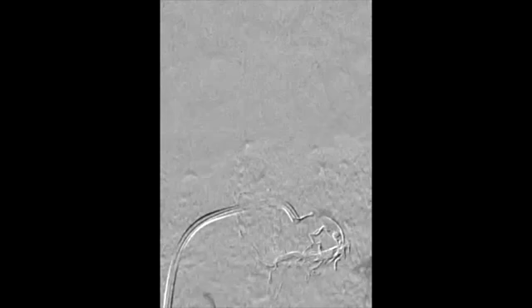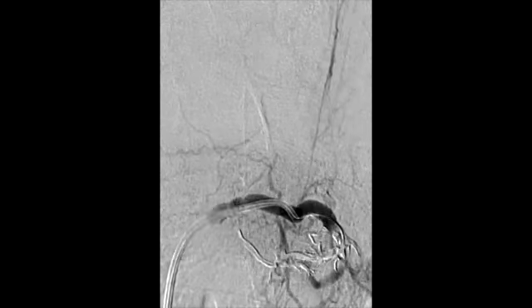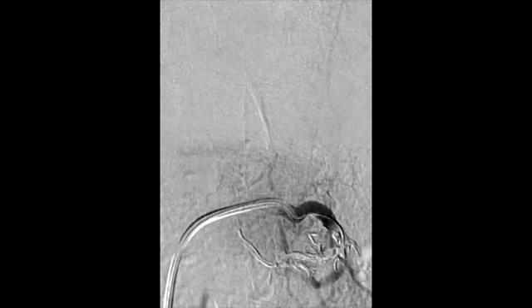fistula. The goal was to occlude the fistula point and in a retrograde fashion deploy Onyx within the arterial system. Onyx is deployed, obtaining excellent penetration into the proximal connecting vein. At this point, an angiogram was performed from the guide catheter, showing no evidence of early venous drainage. The microcatheter was removed without complications.